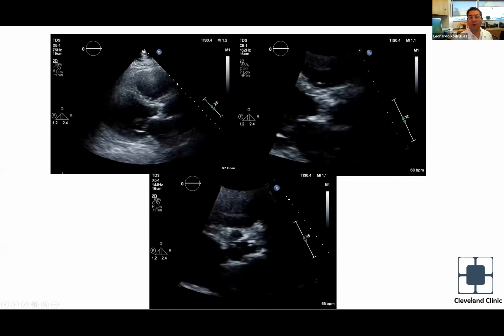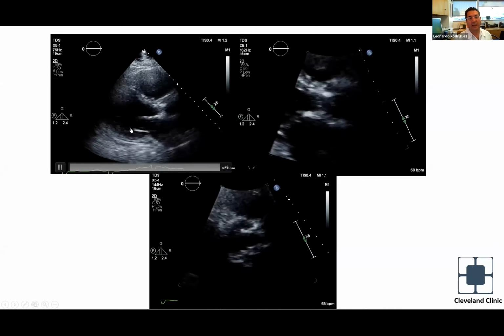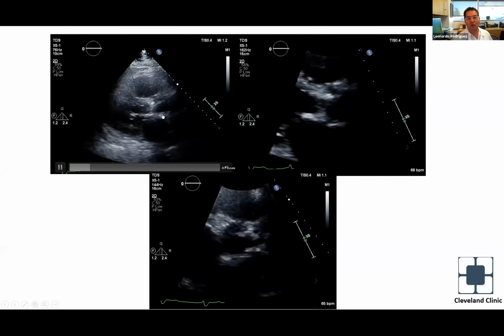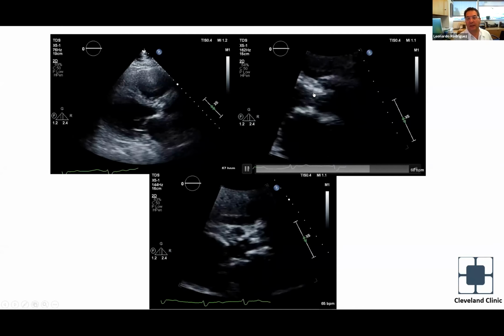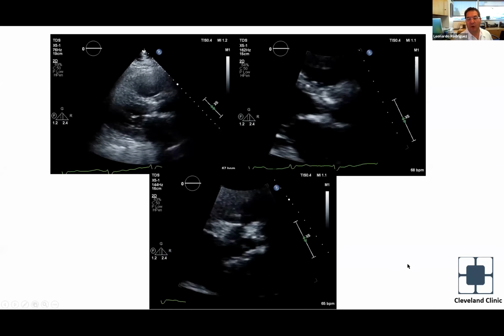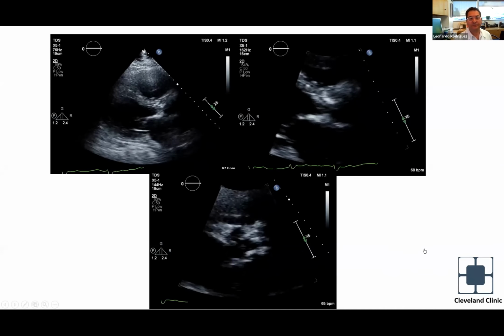Este es un ejemplo donde pueden ver ustedes las limitaciones y las ventajas de la ecocardiografía. Pueden ver ustedes la función ventricular izquierda bien, pero ven ustedes que en este caso particular, clásico del área donde trabajo, las vistas no son óptimas. Ven ustedes que la calcificación a nivel de la válvula aórtica y del anillo hace que estos bordes no sean particularmente nítidos. Ven ustedes en el eje corto de la válvula aórtica que incluso la anatomía, si es bicúspide o tricúspide, no está claramente delimitada en este caso.